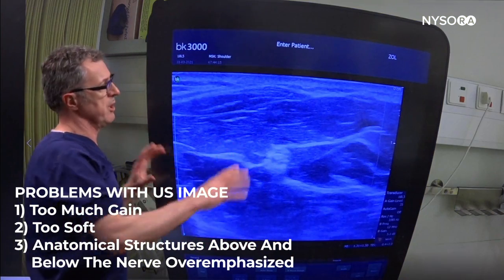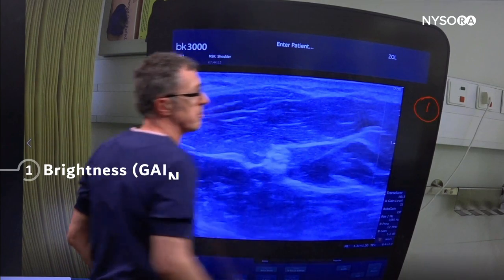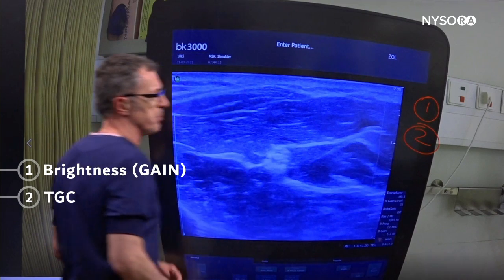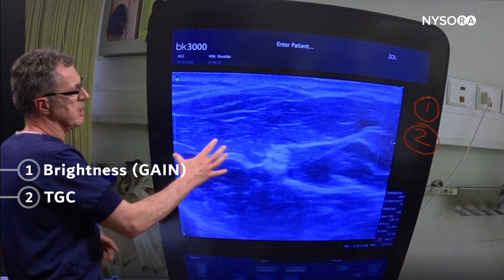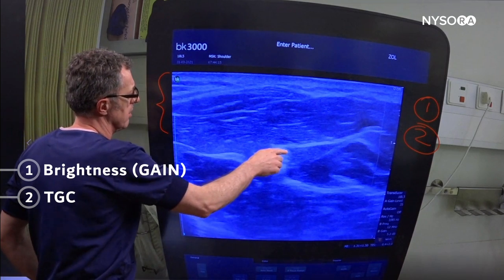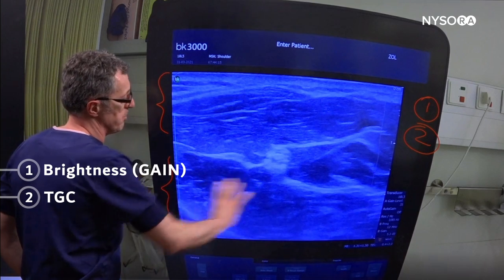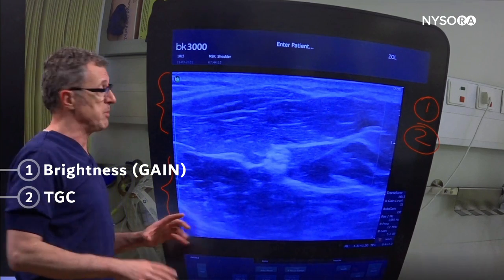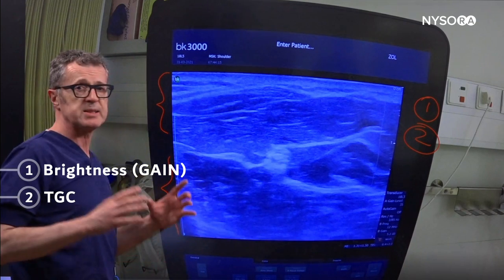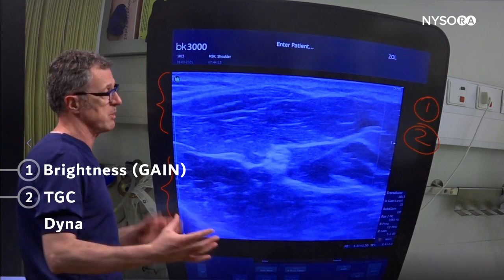Let's discuss this image. The image is still too bright for my liking, so brightness is number one element we'd like to fix. Number two is time gain compensation — I'm seeing too much gain on top around the median nerve and fascia we're interested in, and too much gain on the bottom, whereas I'm not getting enough contrast around the median nerve and the fascial sheets that surround it, which is most important for this particular block.